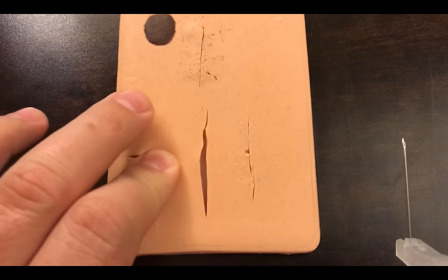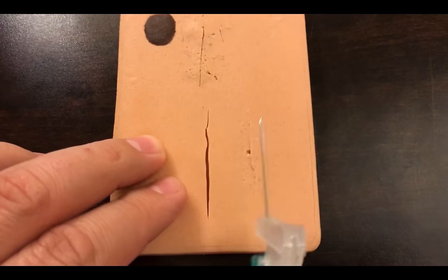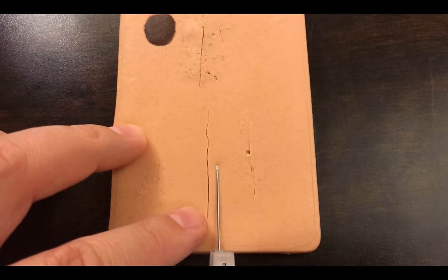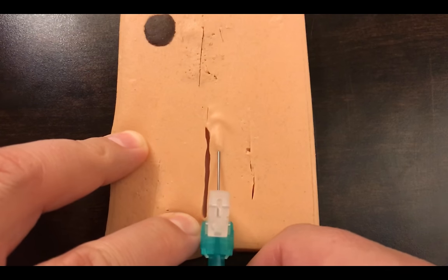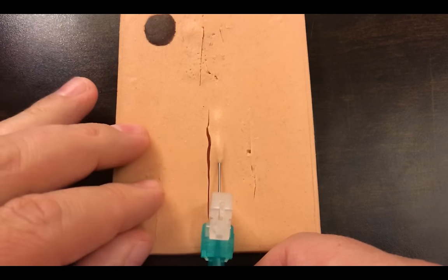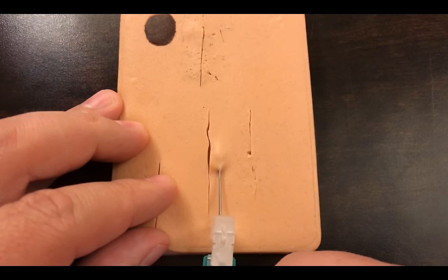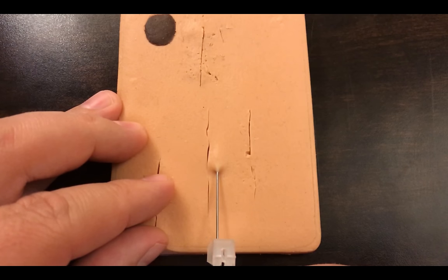If this were a dirty laceration requiring a lot of cleaning with infection concern, I'd clean the outside with an antiseptic and inject from outside the skin edges. I advance along the skin edge, but my point of entry is outside of the laceration. Same idea — pull back on the plunger just a little to make sure I'm not in a large vein, then slowly inject as I withdraw. The slower you inject, the less painful it is for the patient, though it will still feel like a poke and a burn.